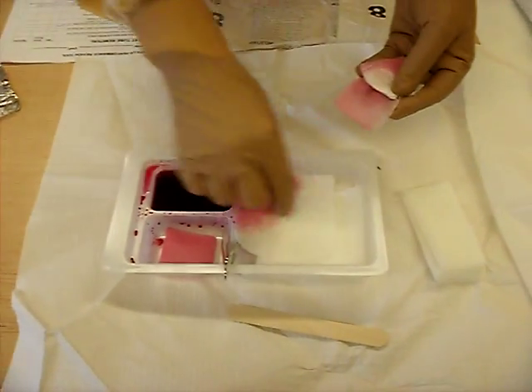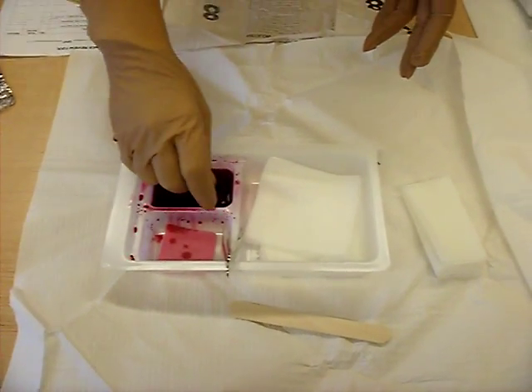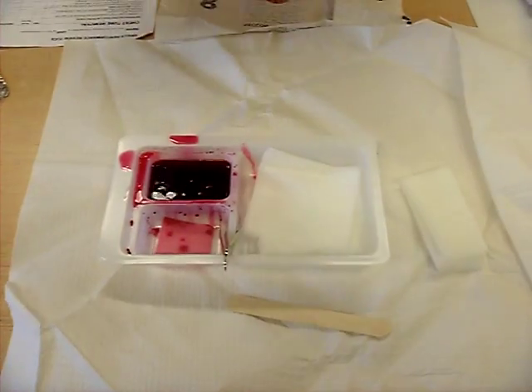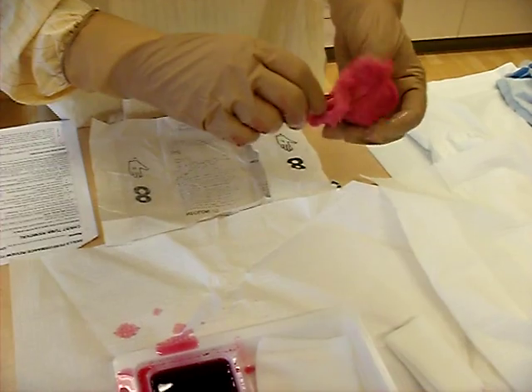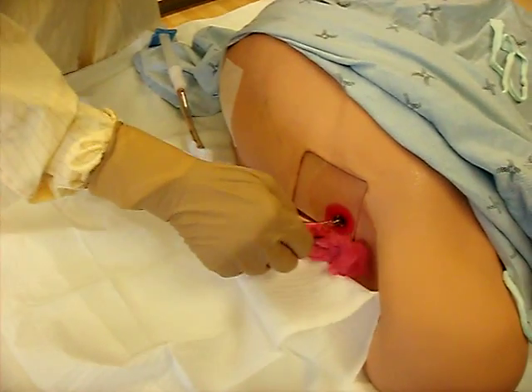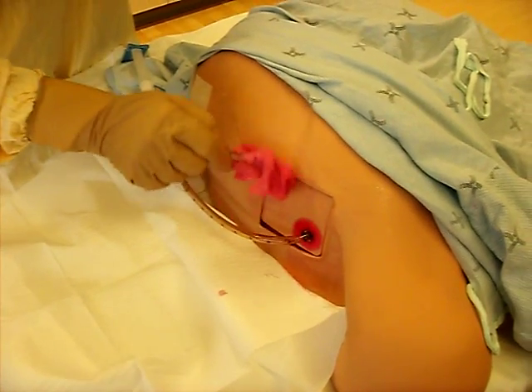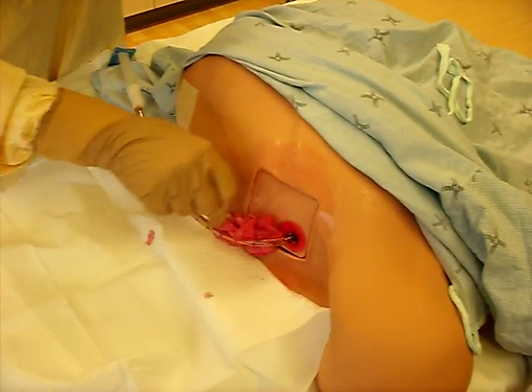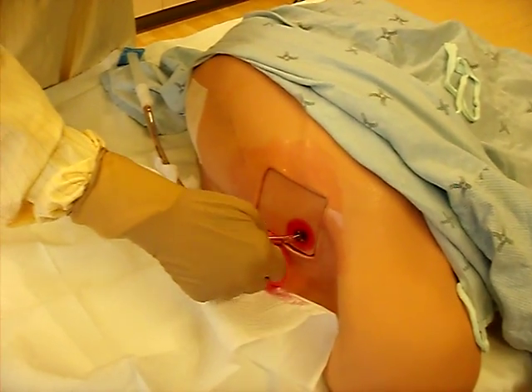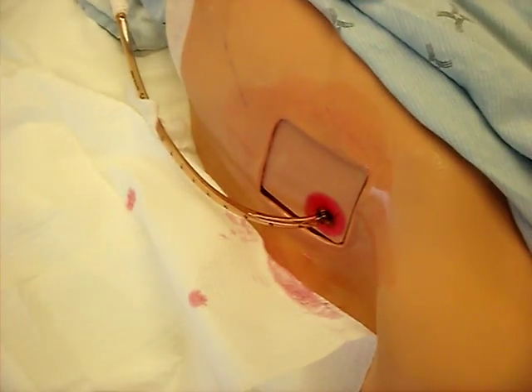Your standard dressing tray, you're just going to take your gauze, use your sterile chlorhexidine gluconate and your alcohol combination. This is a tinted one, so you can see where you've cleaned. You can either use your hands if you feel you're really good with them, or you can use your forceps, so you're not going to be around the tube. And of course you're going to scrub and clean any of the exudate around the tube, which there will be, all the way around, maintaining sterility of course, cleaning the tube, cleaning around the suture. You can do this 2 or 3 times again.